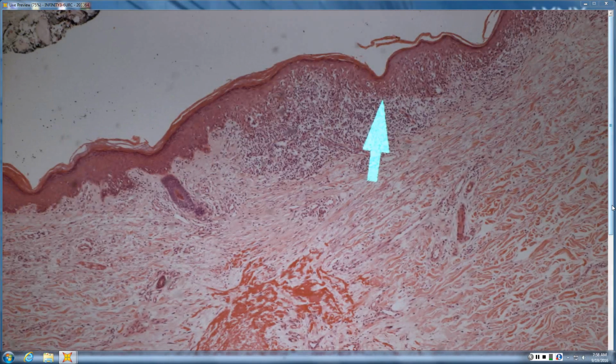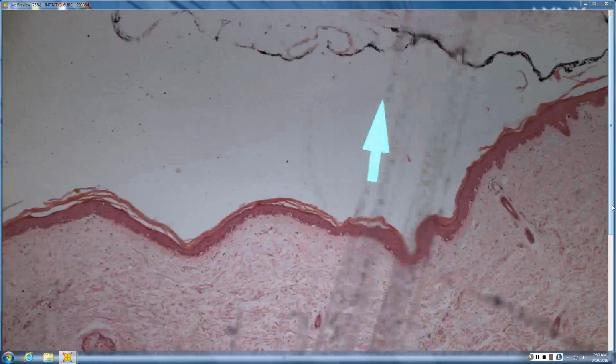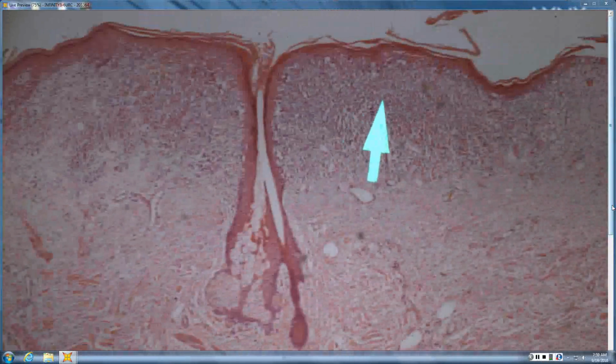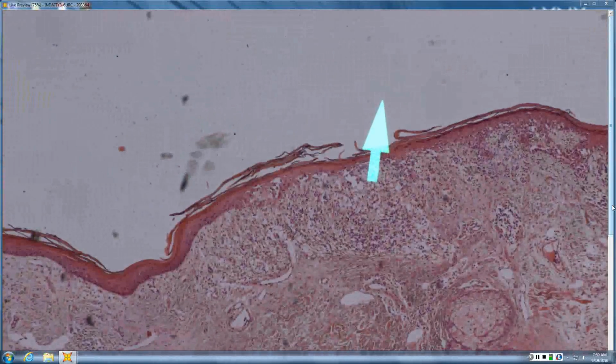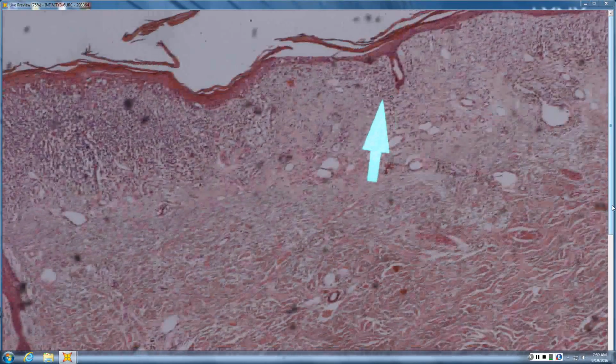So this looks like total obliteration of the DEJ there. So I'd call it lichenoid. So a lichenoid interface, and it's big, so you would think of melanoma. In this case, they didn't actually find melanoma. Probably used to be melanoma. This was big because they were pretty sure it was a basal cell when they scooped it off.